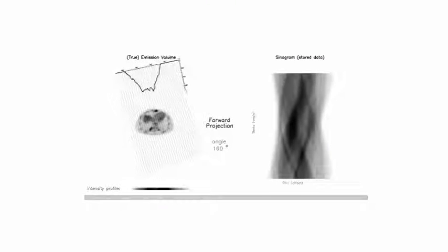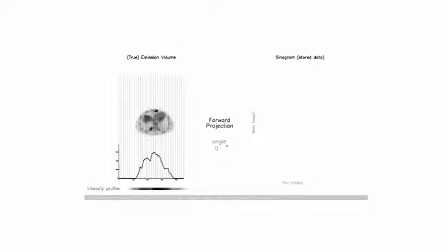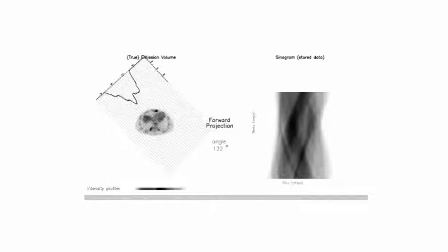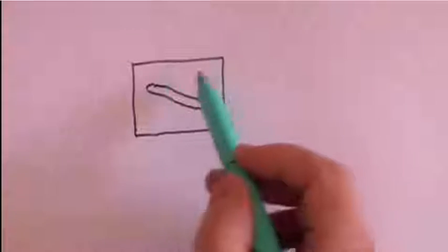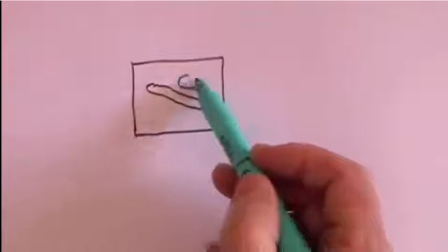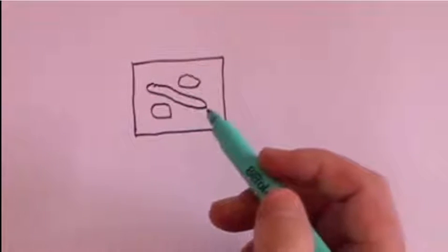We take an X-ray image at several angles. Then we use computerized algorithms to process these images in order to get a three-dimensional reconstruction that represents the internal structures of a patient. The problem with an X-ray is that it is a two-dimensional image. You can know a little bit about the object, but you cannot know the depth of the object. This is why we use CT, because it takes X-rays to reconstruct a three-dimensional image.